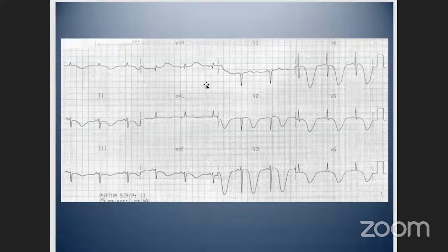Okay, so the pitfall with ECGs is that we see these obvious downward sloping or massively inverted T waves, and then we can fall off the bus and be scared and not really know what we're saying, and that's why we tend to not want to do ECGs or not want to interpret them. But if I still follow my approach to ECGs, I can see that this is a regular rhythm. It has a normal axis and or even left axis deviation.